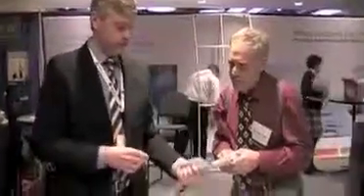My biggest criticism of the McGrath when using it is that your hand is really, really close to the person's face. Interesting. You approximate really quickly. Maybe because I just hold my laryngoscope a little bit low. Fair enough, a lot of people do. I think it's a leverage issue, but I find that your hand is resting on the upper lip. There's not a lot of space.